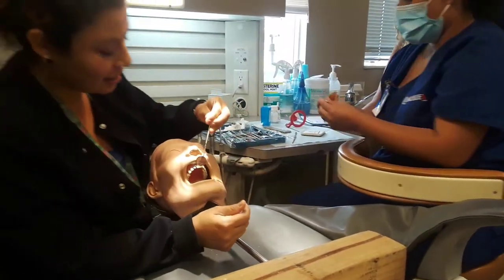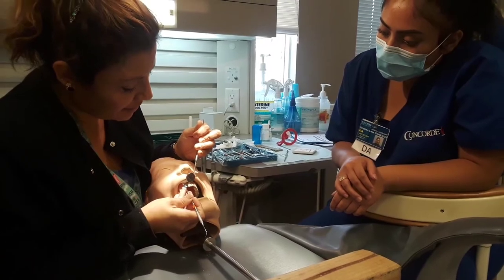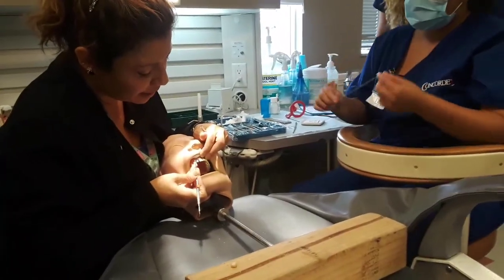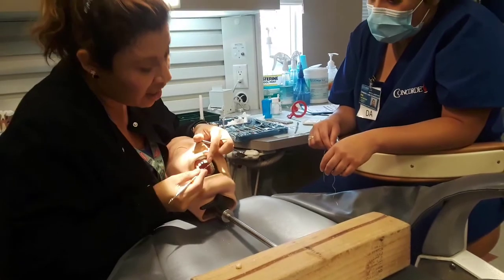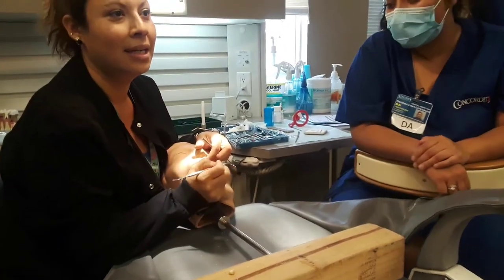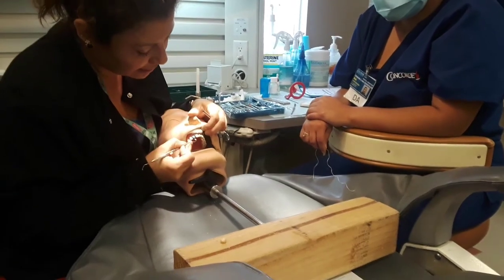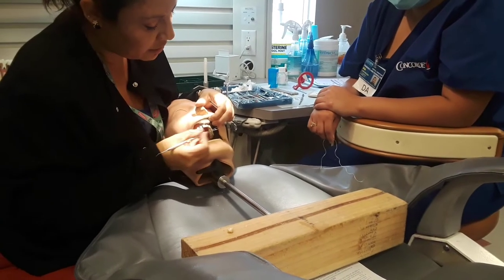Three minutes have passed. She's going to pass me — dentists always keep their mirror. I'm going to remove the excess cement above the margin — that's where it went, all the way up in that gum. I'm going to remove that all around my crown. I left my cotton roll in here so I can wipe my instrument there instead of having my assistant wipe it.